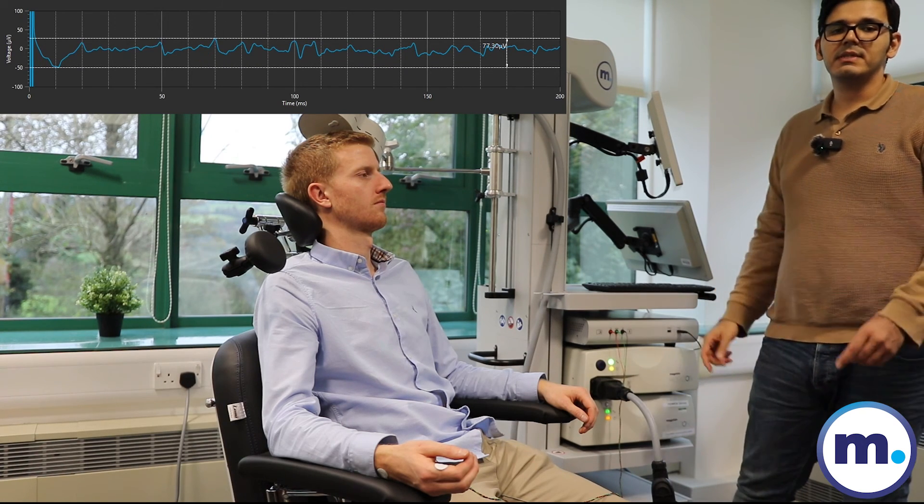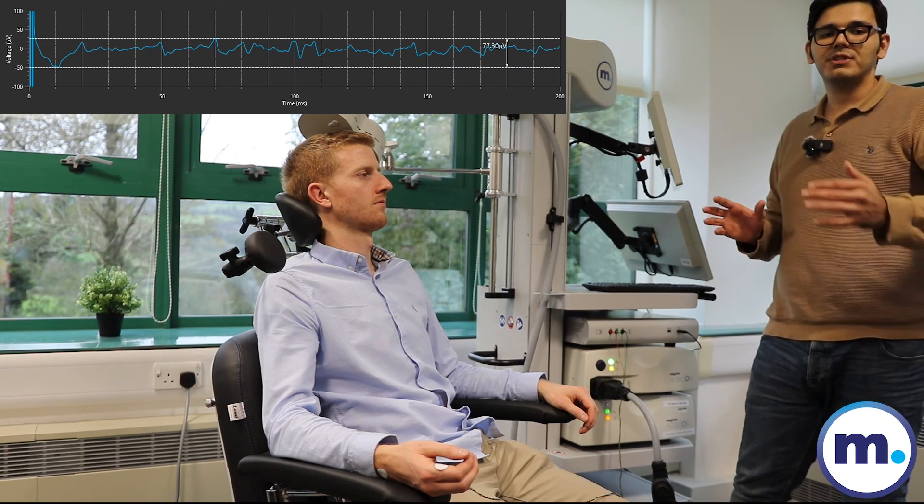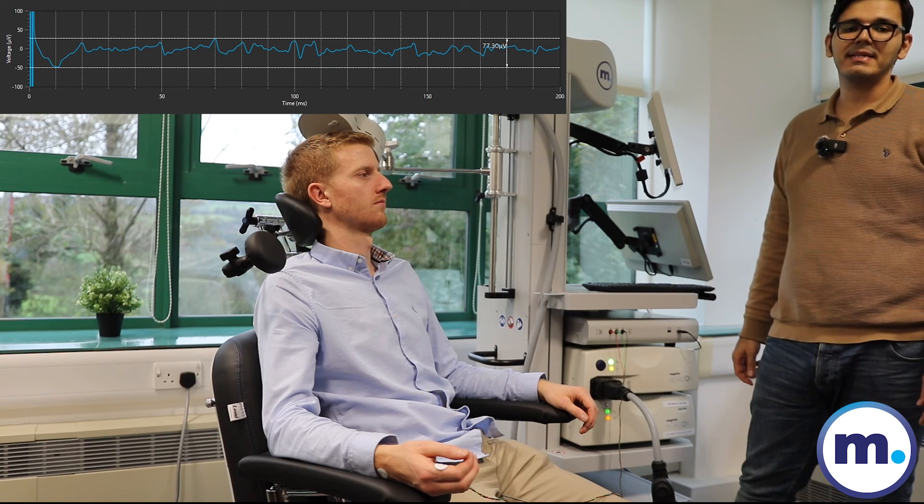I try to fire the pulses with random intervals, and also try to keep them more than two or three seconds apart, just to not have any plasticity effect.